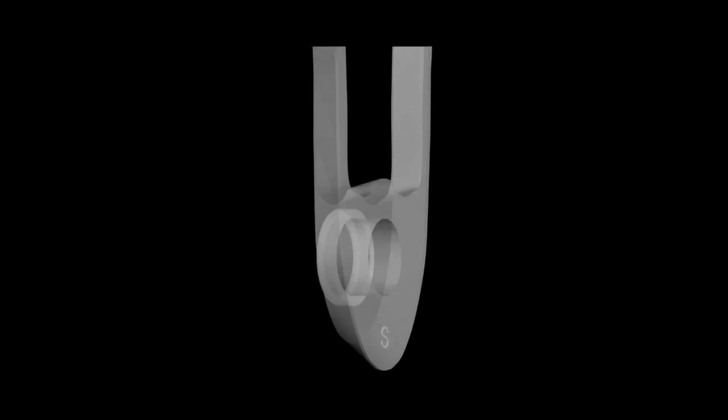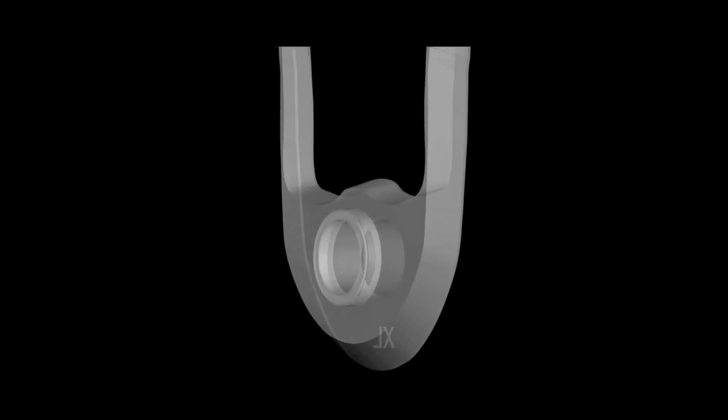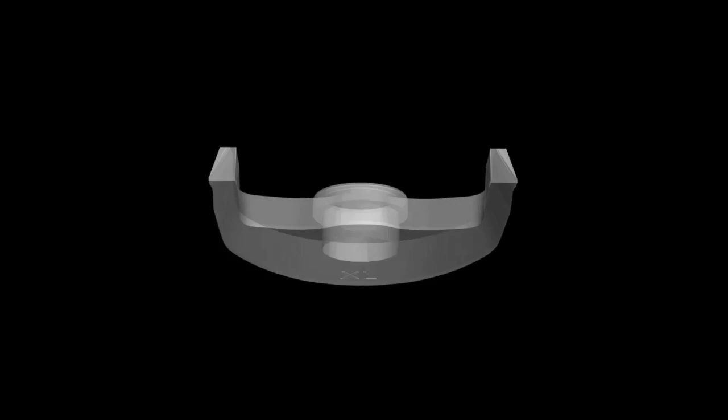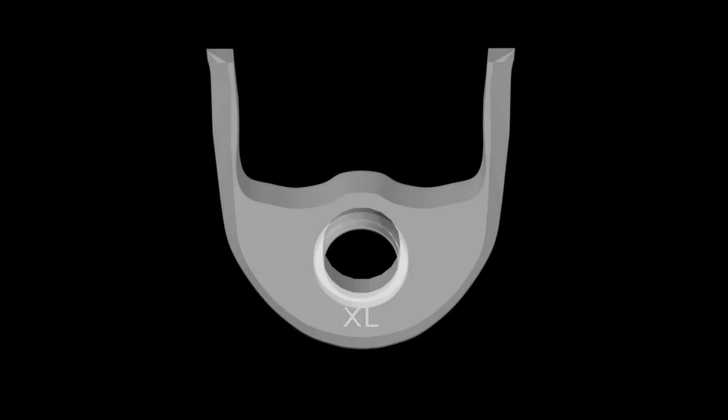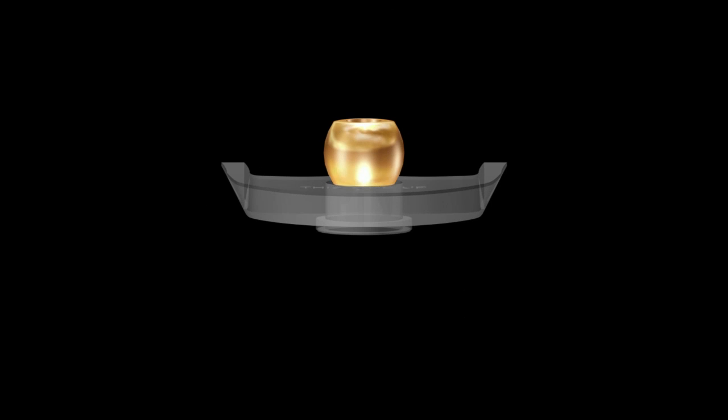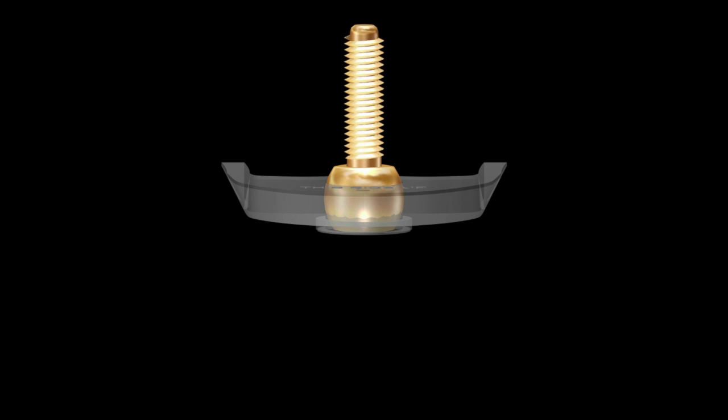The modified pin receiver is supplied in four sizes: small, medium, large, and extra large. It differs from the other pin receivers in that the circular projection is mounted downward to conserve space, and the pivoting nut and vertical pin are inserted from the side opposite the projection.